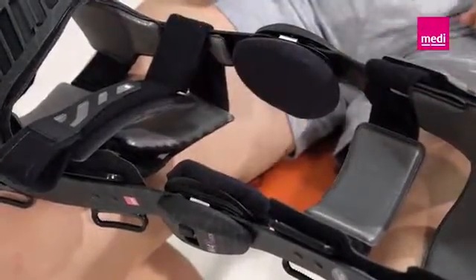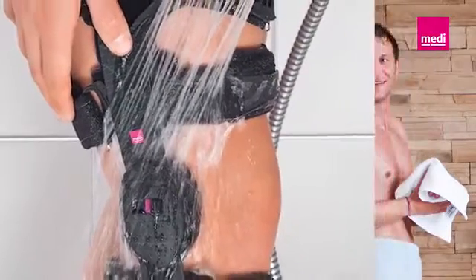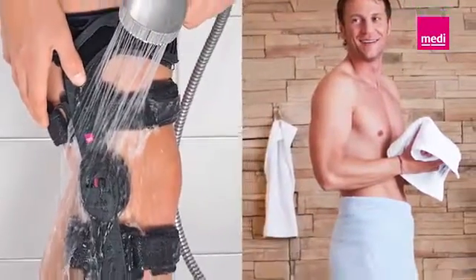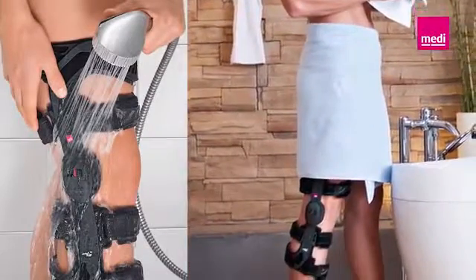The inner pads and condyle pads can be washed by hand in cold water and a mild soap solution. Leave them to dry in the air. You can also wear the Mediven M4S lock orthosis in the shower. Please make sure, though, that the injured knee is always kept straight and the orthosis hinge is locked.